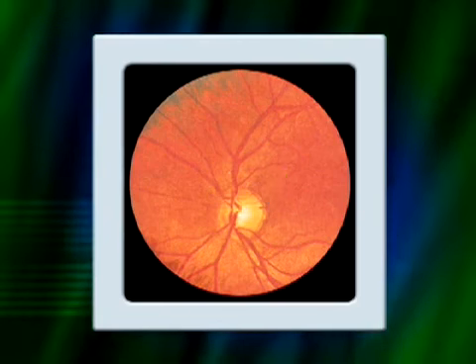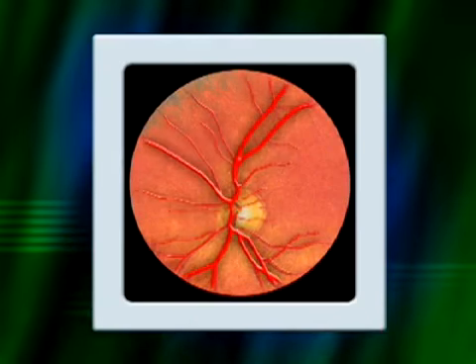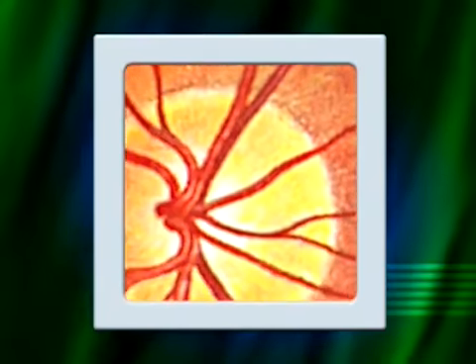Because you can really only see a small part of the fundus at a time, use the blood vessels as landmarks. Blood vessels branch away from the optic disc, so you can trace them back to find the disc. Then follow the blood vessels distally as far as possible in each quadrant. The arterioles should appear smaller, brighter, and redder than the venules, and the arteriovenous crossings should show no nicking or other changes.